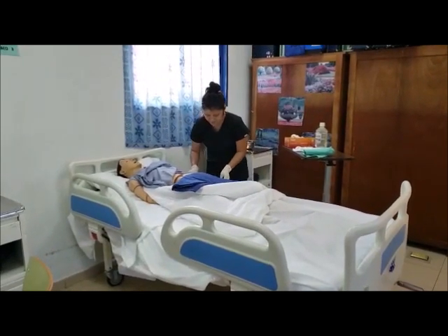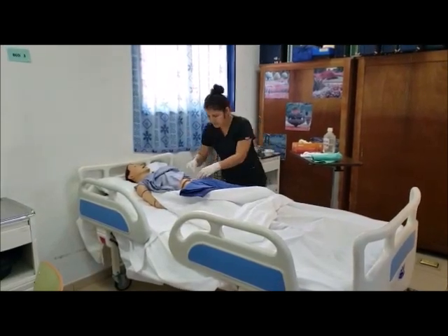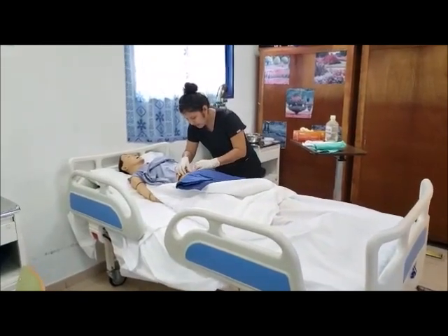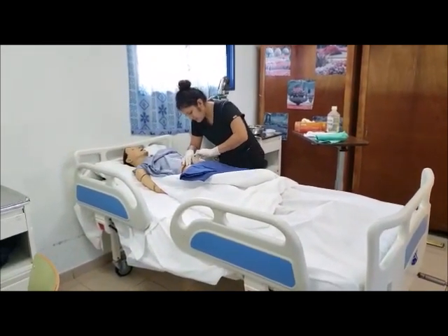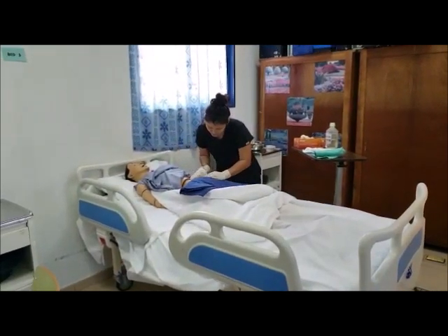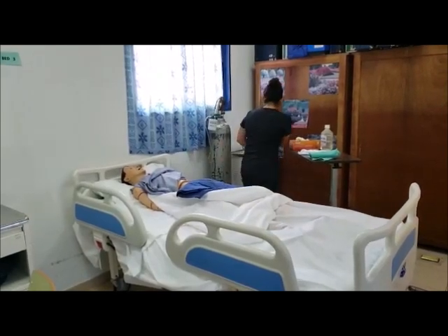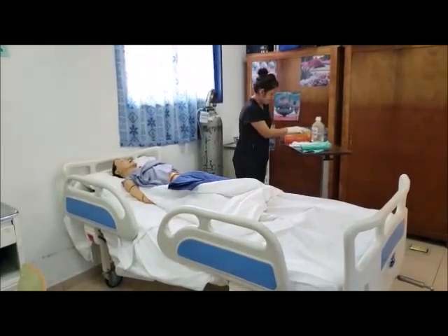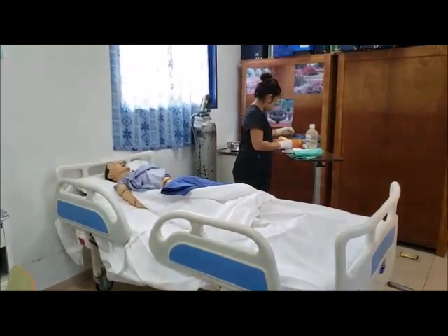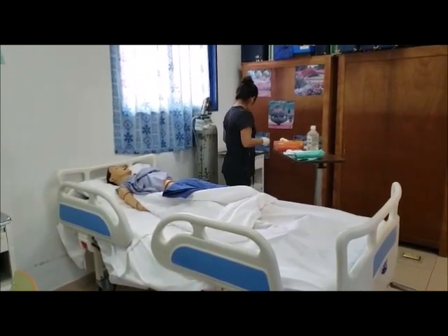Remove pouch by pushing against skin as backing is pulled from the skin for counter pressure. Removing it now. Does it feel any pain? Pouch is discarded in plastic bag. Output is measured. Skin and stoma are gently cleaned with warm water and soft cloth.